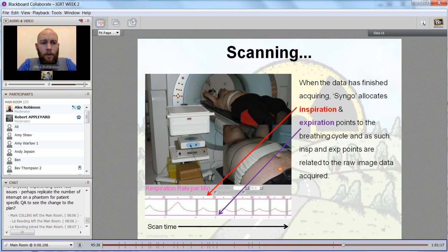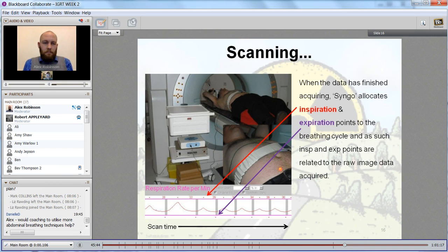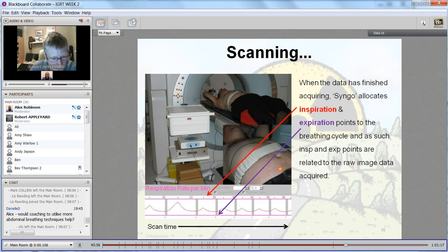So it's a very valid point, Rob. It'd be interesting to see with the infrared system if you have the same issues, because essentially we've put in this direct connection between abdominal motion and diaphragmatic motion. And that's obviously what we do because there's no other method. However, there may not be that correlation. No, that's a good question about the RPM system. Have we got people here in the webinar tonight who use the RPM system?